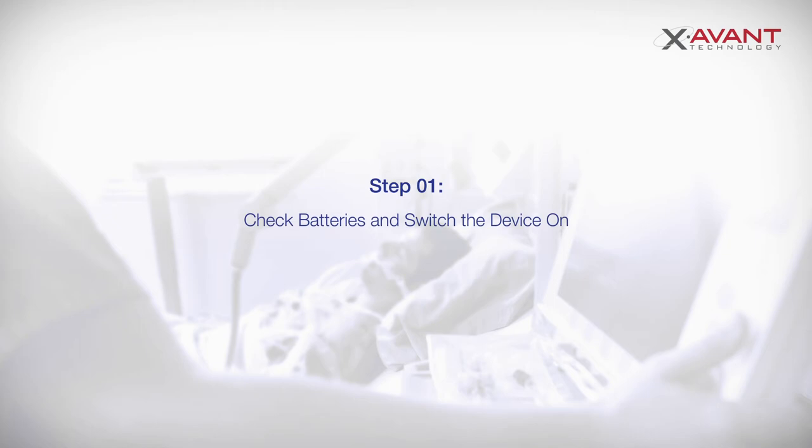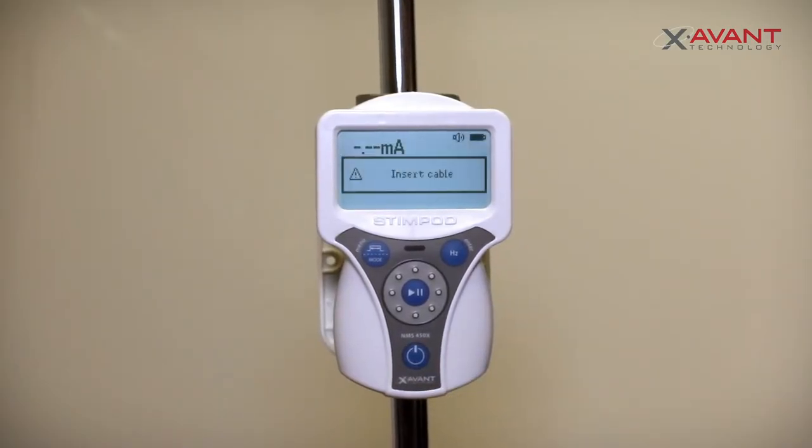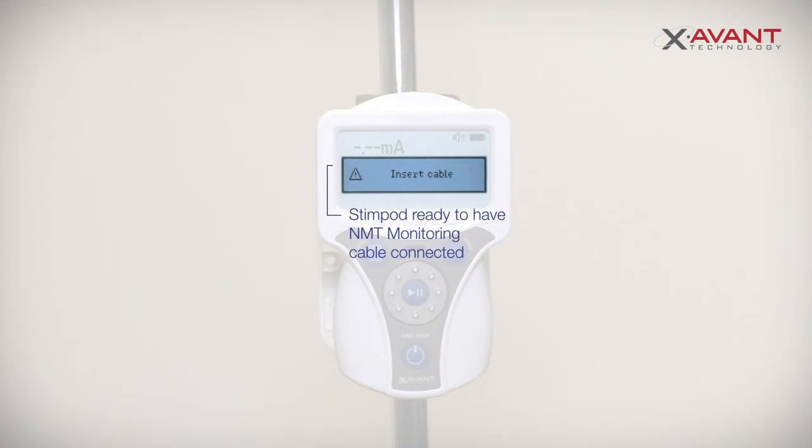Start off by checking that the batteries have been correctly inserted and switch on the Stimpod. An 'Insert Cable' screen prompt will appear. The Stimpod is now ready to have an NMT monitoring cable connected.